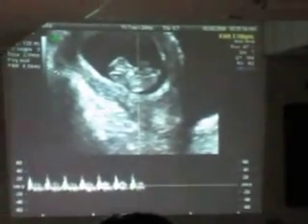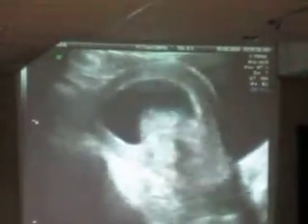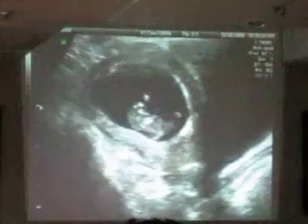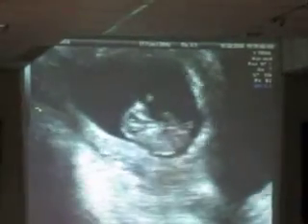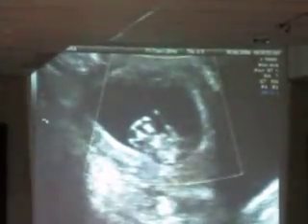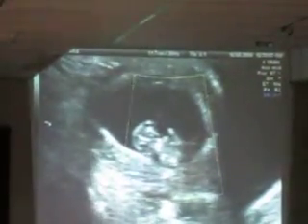Can you zoom in, please? Sir, suppose you find the sac is low down in a case of previous cesarean section, and the chances of it implanting on this scar are very high. This question is for even the seniors. Do we have any way of predicting whether it's going to be an accreta? Should we go for a termination?